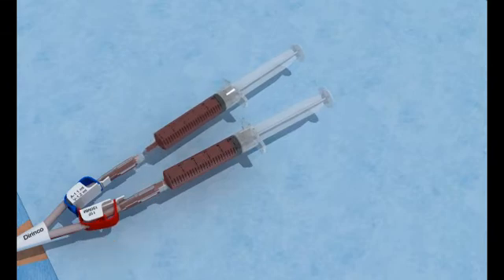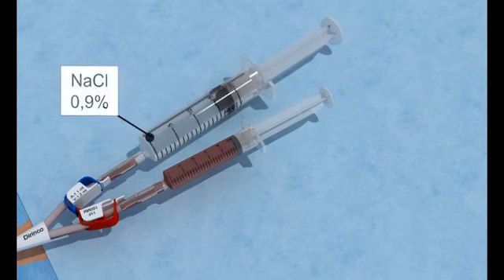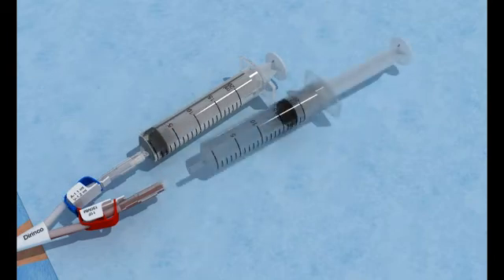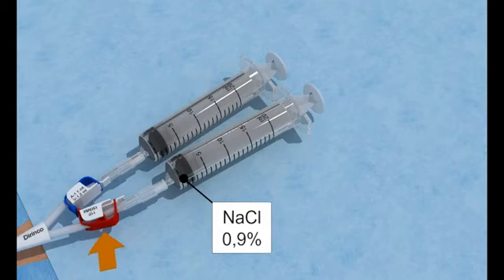Flush both lumens. Replace the aspiration syringes one by one with 20ml syringes filled with a sterile 0.9% saline solution. Open the clamp and flush the lumen. Close the clamp. Repeat the same procedure for the other lumen. Leave the syringes in place to block the ports.